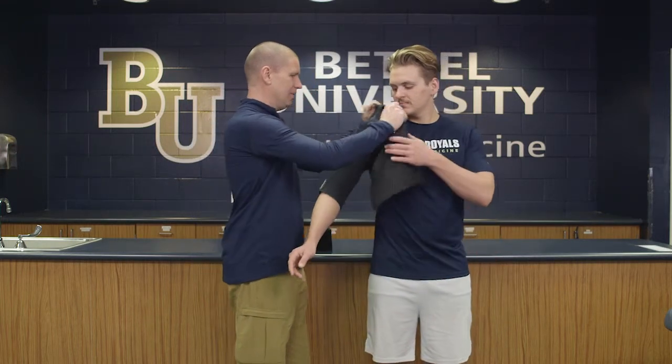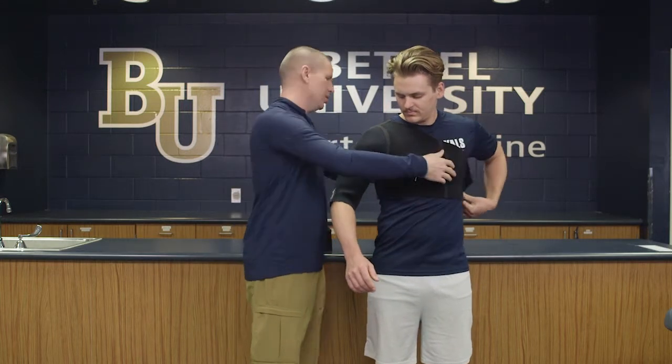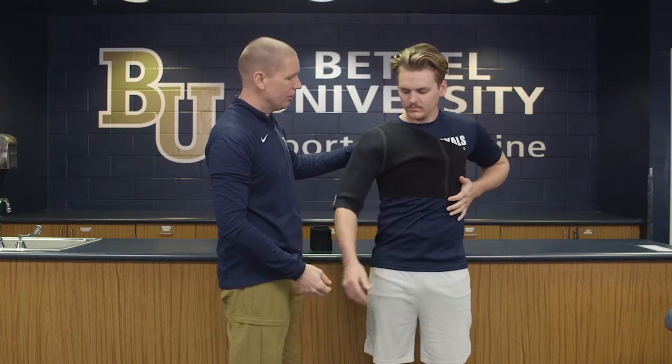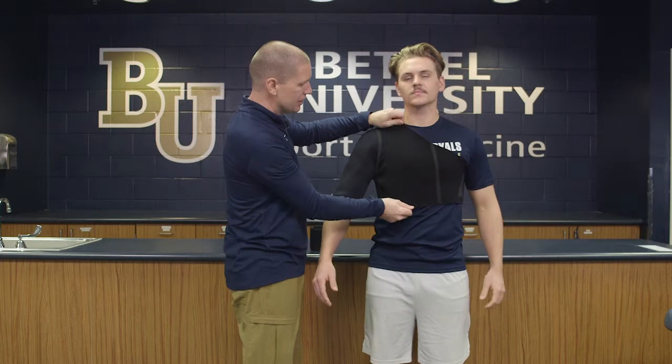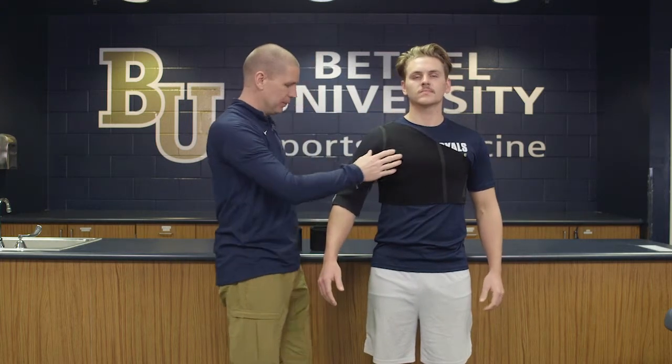We're going to place this onto an individual, kind of like you would put on a shirt. This could go on over a compressive shirt or under their jersey — it doesn't necessarily matter, but you do want to make sure it's good and snug. If it's too loose or falls off, it's really not going to do what it needs to do.